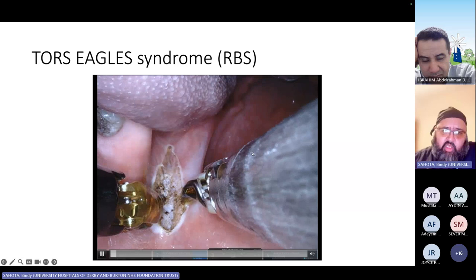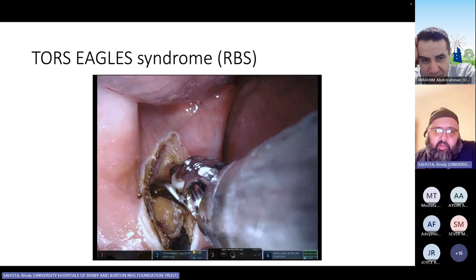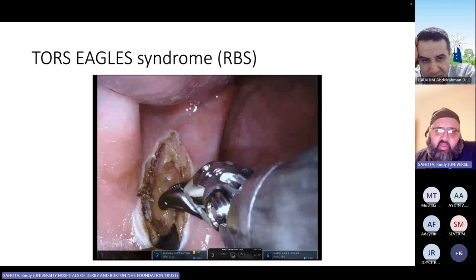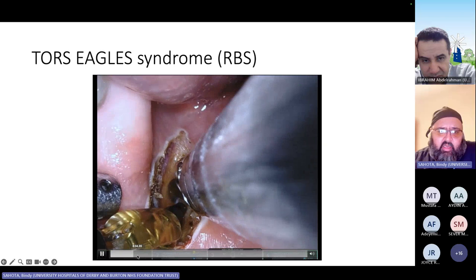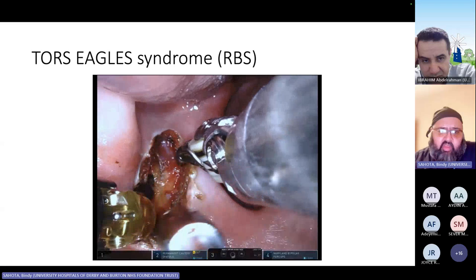I then just open up the plane, get into the parapharyngeal fat. I deal with the blood vessels with bipolar, just to keep the plane really, really dry. And as I'm doing this, I want to open everything up because you don't want to be destructive, because this isn't a cancer operation. And you'll see within about 16 minutes, we'll get down to the eagles and get it out. And you just want to keep it really, really dry because you want that view to be really obvious. You can see down there, there's a big pumping blood vessel looking right at you.